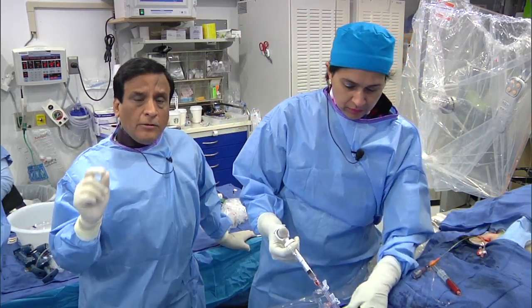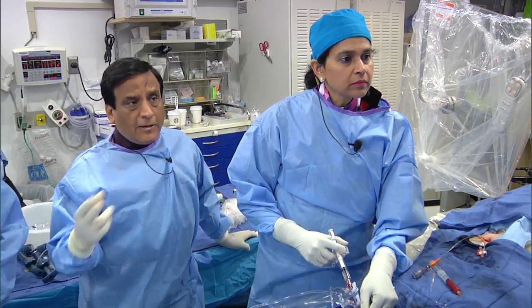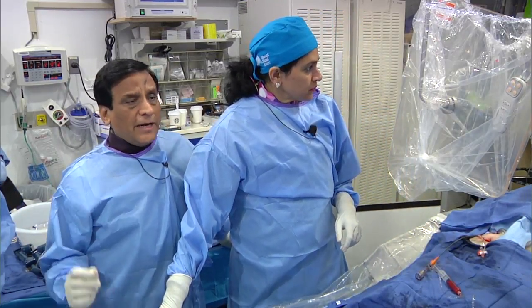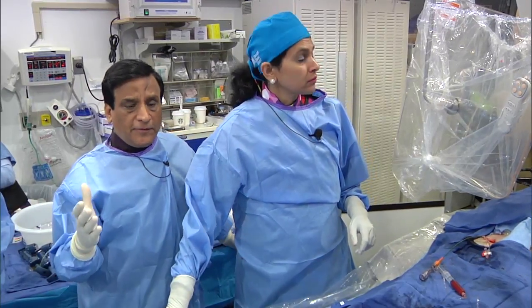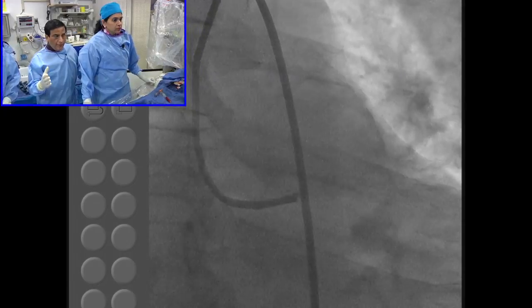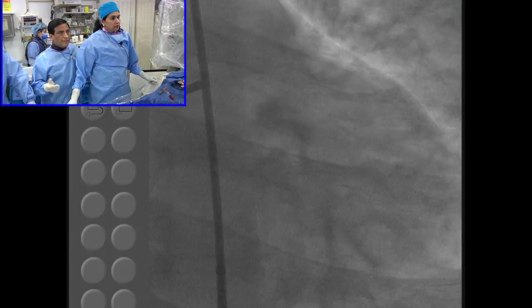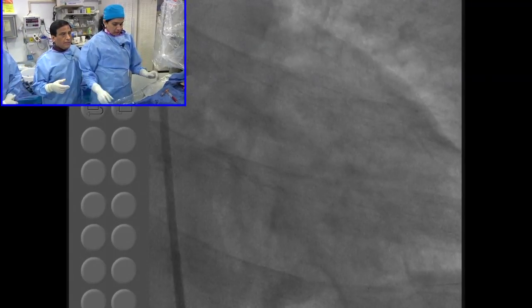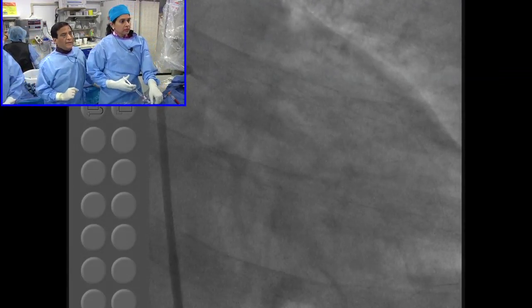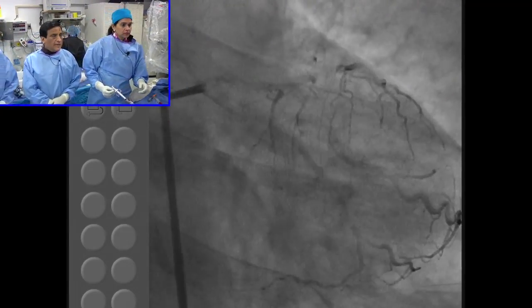I mean, very simple. You'll have a lower myocardial infarction and you'll have lower stent thrombosis. And to me, both those events will work in favor of causing the lower mortality, because that was the biggest difference: 5% mortality difference in the PCI with the first generation DES paclitaxel compared to CABG. And if we extrapolate the available data of the everolimus eluting stent, the Xience and Promus, clearly the difference to me will narrow, could even be identical. With that note, I'll stop here, and Anu is ready to take a guide picture and start the work.